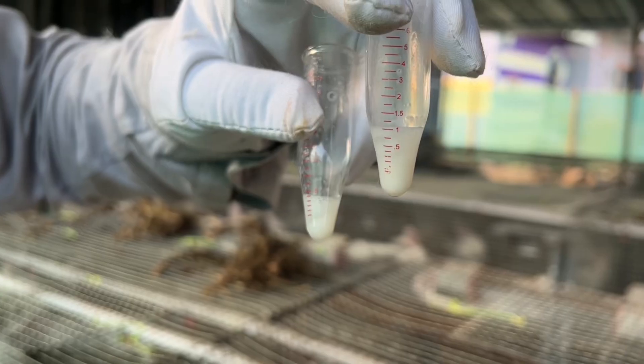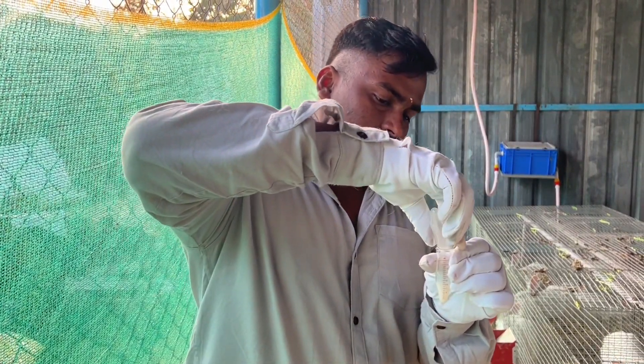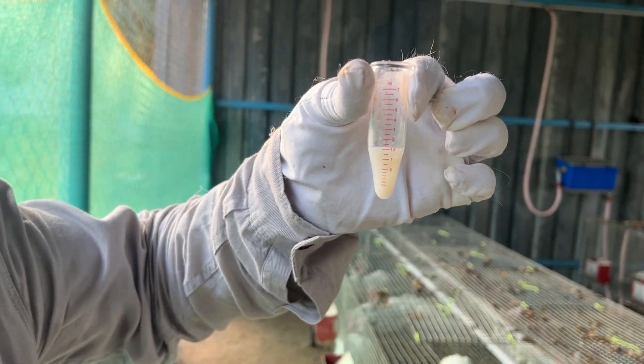We have Sample 1 and Sample 2. We are collecting semen from two different rabbits and we got 1.5 milliliters from both rabbits.